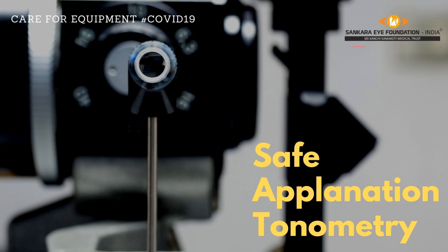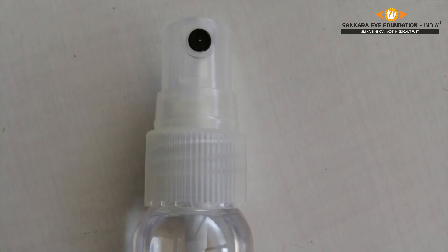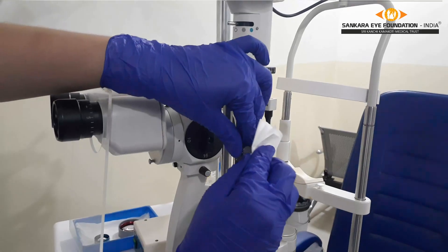This is a short video on precautions to be taken during a Goldmann applanation tonometer examination. Before proceeding with the examination, the applanation tonometer is cleaned with 70% isopropyl alcohol and dried with a clean tissue paper.